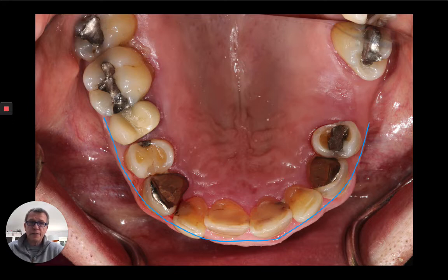And when you look at this, how much benefit do we gain from it? Because we could probably restore those front teeth and achieve the same sort of solution, particularly for a gentleman of Ray's era. So, sometimes it's appropriate, sometimes it's less appropriate. We just got to think.